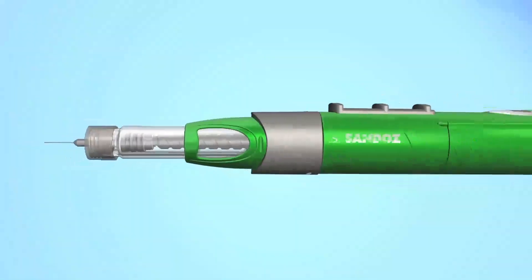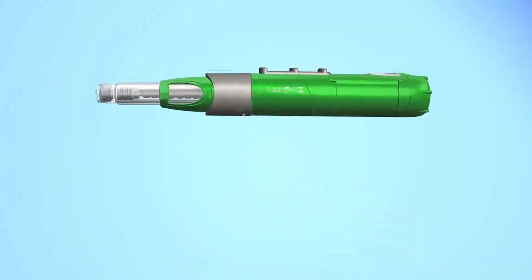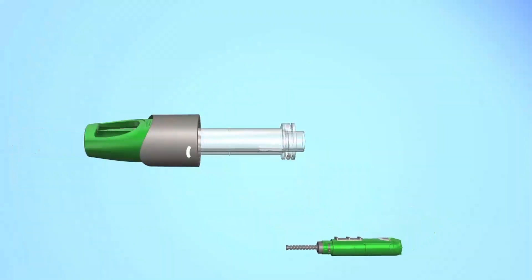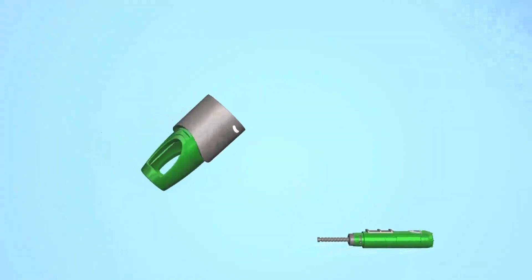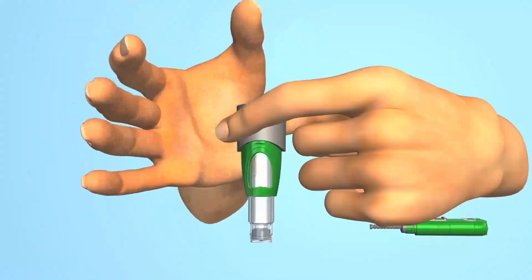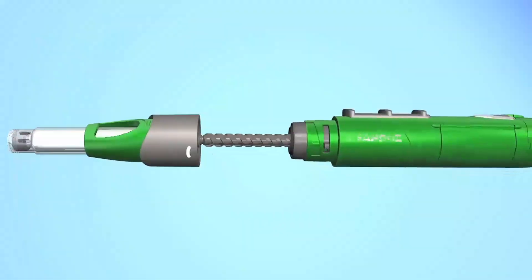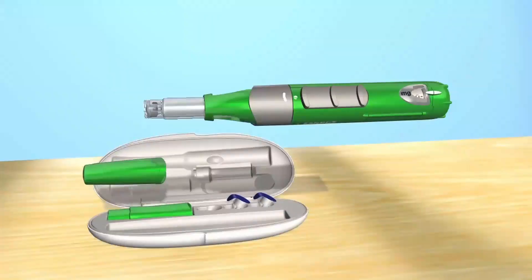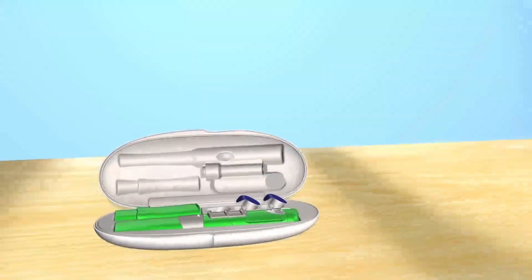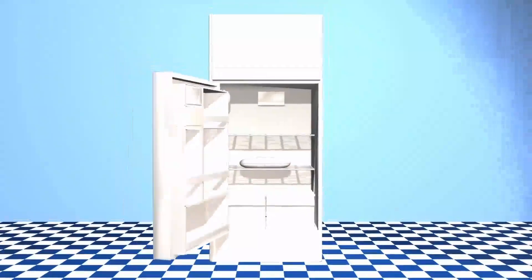If the cartridge is empty, remove and discard the needle. Then unscrew the locking ring and push on the end of the preassembled cartridge to take it out of the locking ring. Discard the empty preassembled cartridge and put a new preassembled cartridge into the locking ring as in Chapter 1. You can then reattach the locking ring with the preassembled cartridge to your SurePal, put the pen cover on, return your pen to the hard case, and put the whole case in the refrigerator between 2 and 8 degrees Celsius.